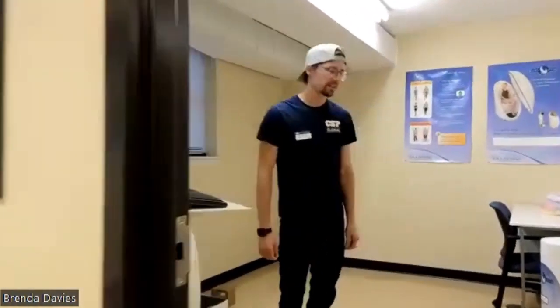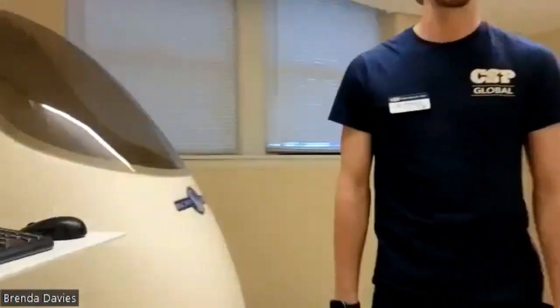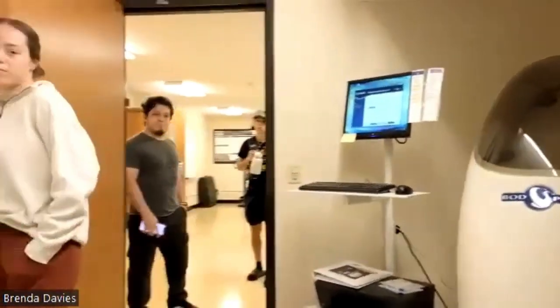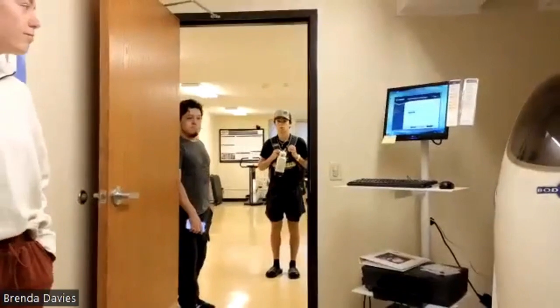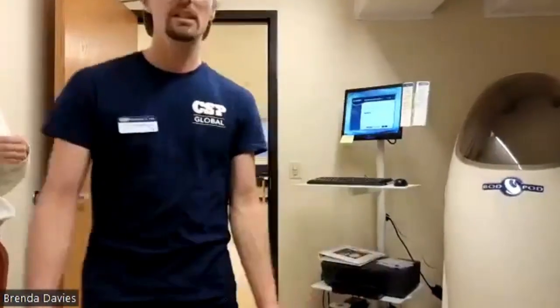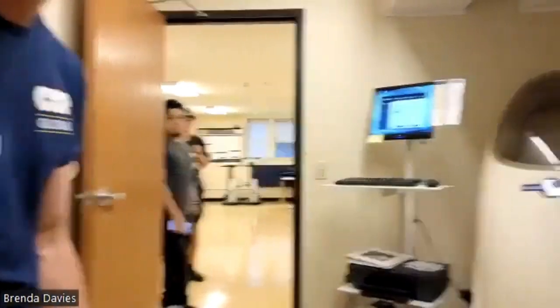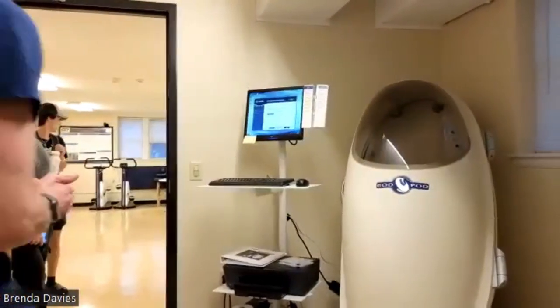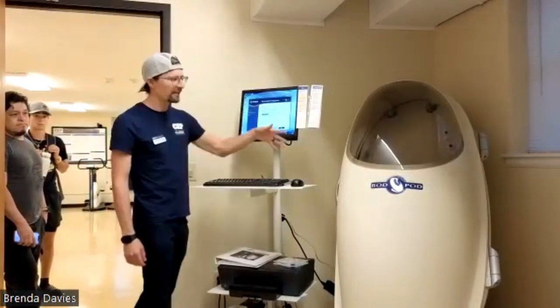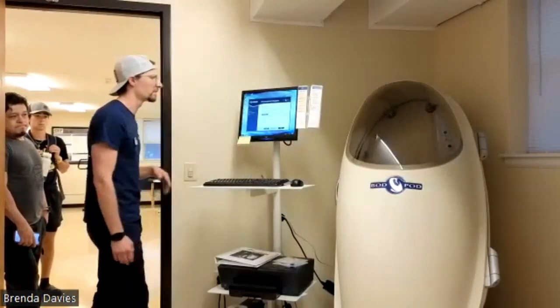If you've never been in or around a Bod Pod, it looks like a space capsule that you could be launched into a Star Wars movie with. It's pretty awesome. Okay, perfect. So how is it set up? We've got the computer, obviously, and the chamber that the person would go into.